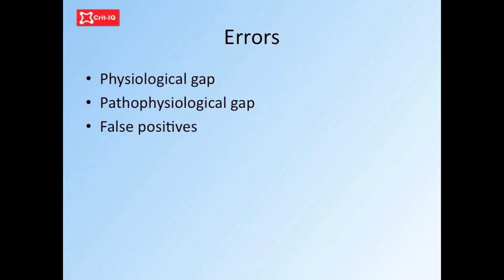A secondary goal of end tidal CO2 monitoring is to monitor non-invasively the patient's arterial partial pressure of CO2. In practice, there is always a gap between arterial and end tidal CO2 levels due to the physiological dead space and shunt. In health, this gap is usually no more than 1 to 2 millimetres of mercury. In mechanical ventilation, and in particular for critically ill patients, the relationship between arterial and end tidal values becomes more tenuous due to changes in perfusion and dead space.